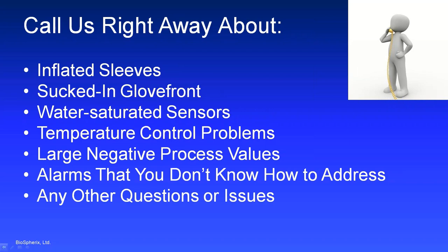If you accidentally water saturate a sensor and you don't know how to dry out the sensors, give us a shout. We're happy to walk you through that. If there are any temperature control problems, it seems like the chamber floor is having trouble keeping a temperature up to 37, please give us a call.